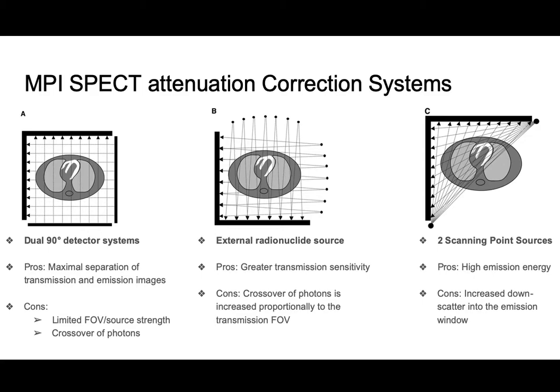So I guess using that system is very helpful to determine whether signals are going to be from the SPECT or the CT. If you use really high energy gamma emissions, then you can see from your detector that this energy level is way above the other radionuclides, which are from the X-ray or CT. So using that system might be very helpful to distinguish between two different radionuclides. But, as I said, it might cause a crossover of photons because they have similar energy.